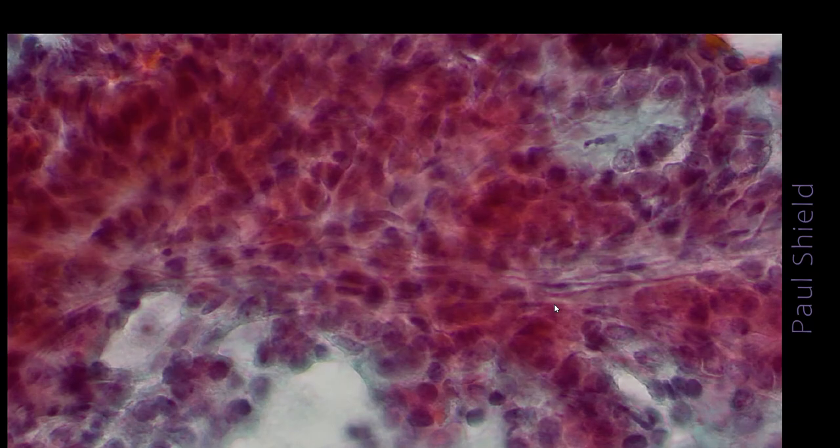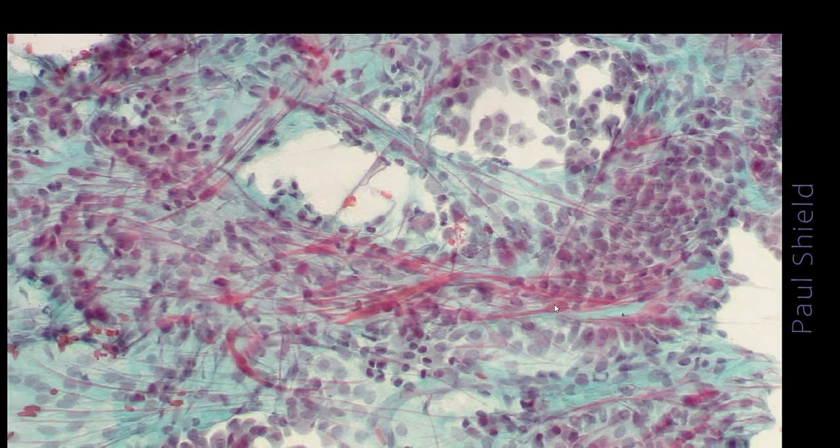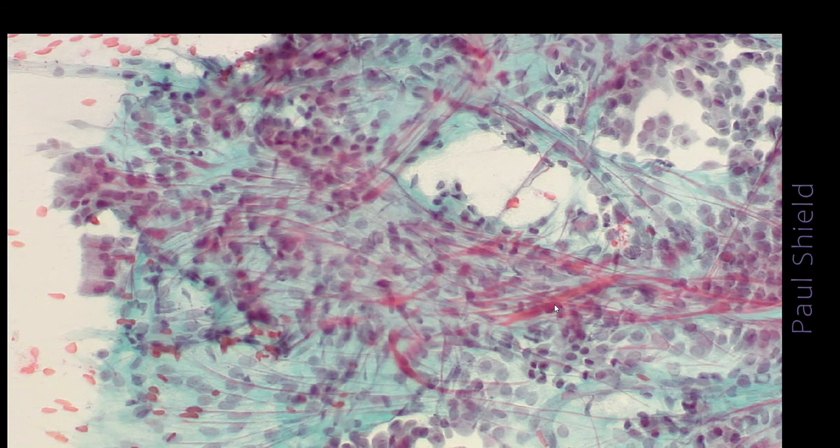And you can see it's quite complicated here. Again, vessels running all through that material. The epithelial cells looking a bit columnar down there. And a lot of them have just stripped off these cores of tissue, but you can see the anastomosing vessels running around there.